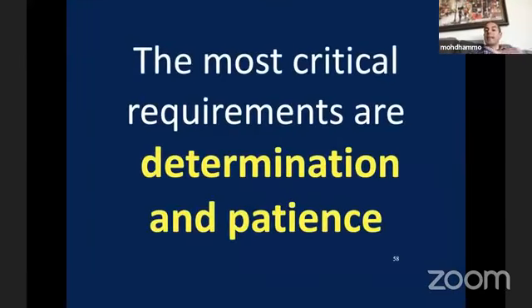So the most critical requirements here are determination and patience. And let me advise you, don't tell any patient that you will remove the broken file. You can tell him, I will try my best to bypass, but the broken instrument usually could not be removed, because our goal is not to remove. Our goal is to reach the end of the canal, either by removing it or bypassing it.